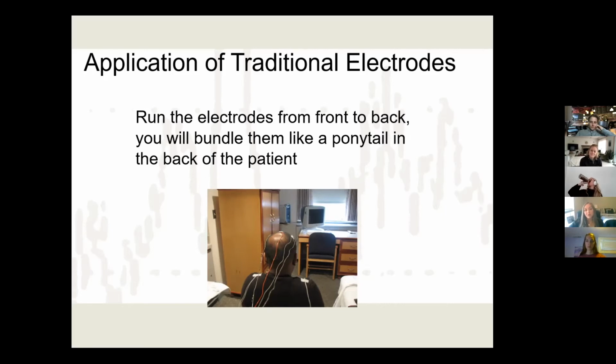With our Mito participant this past time, she asked us to braid her hair because her hair was so long, and with all of the electrodes, it just kept getting super tangly. So yeah, it can be more difficult with thick hair or longer hair, but you definitely can use combs, you can use clips, anything to help you hold the hair back wherever you need to.